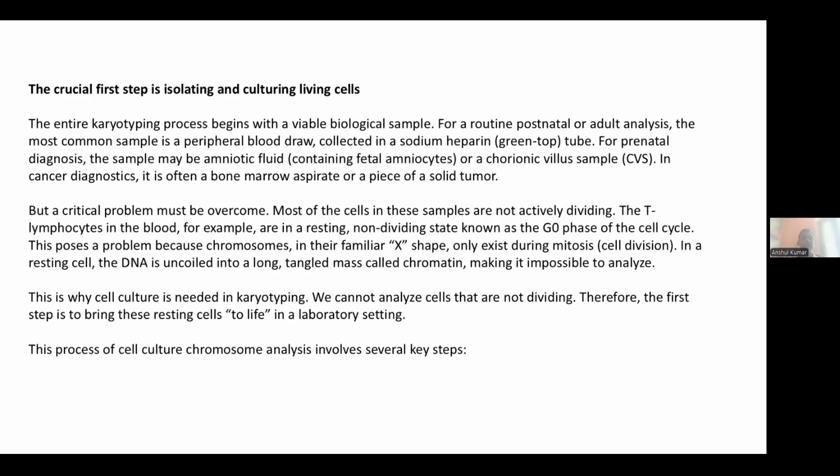So these are different, and the anticoagulant vial which is used for collection of the blood sample is sodium heparin, which has a green top cap, and different samples are used for the diagnosis of different types of disorders. But a critical problem must be overcome. Most of the cells in these samples are not actively dividing.